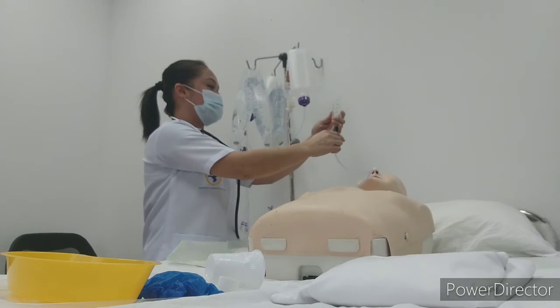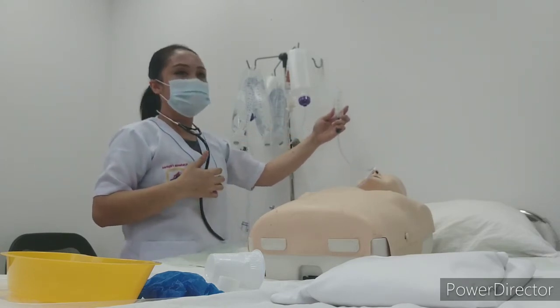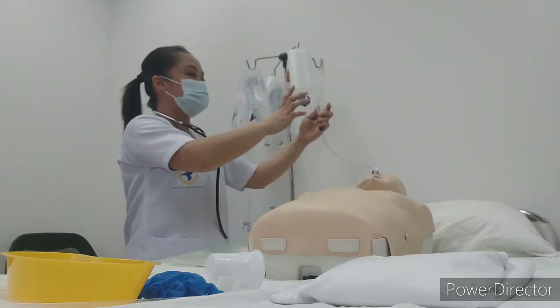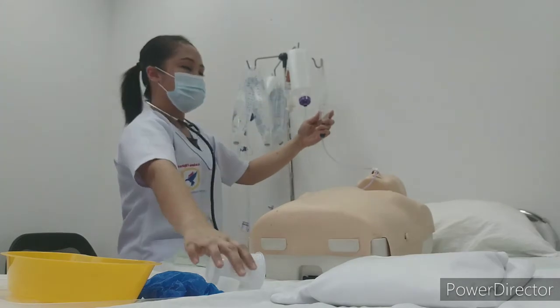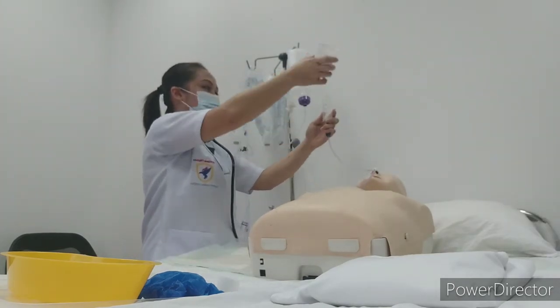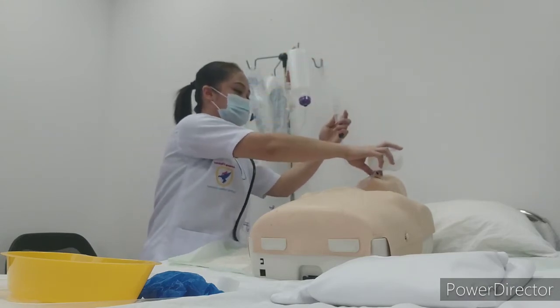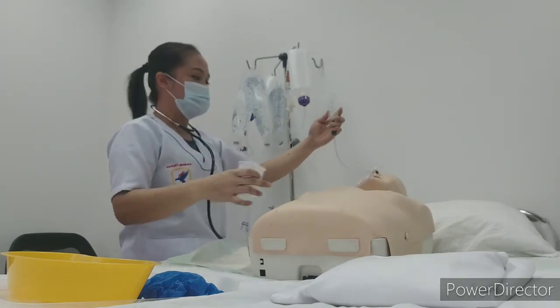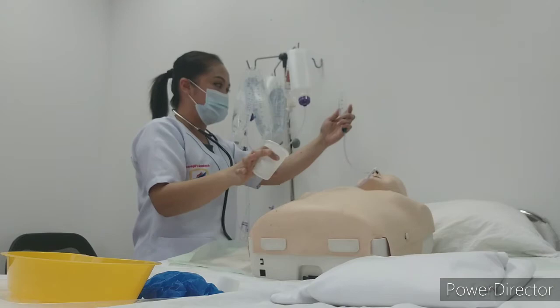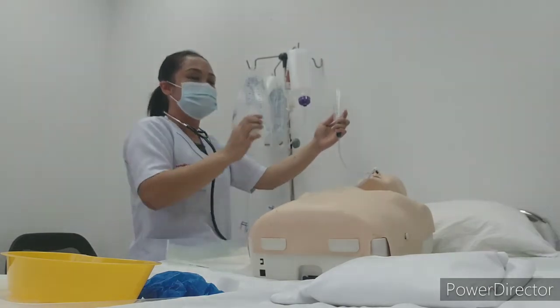So if the doctor's instruction is to order 200 ml, and this is only 50 ml, we will divide it by 4. So 4 times we will feed the patient. 1, 2, 3, 4. So 200 ml of feeding. So after the feeding, when it finished, it's inside already. Again, water flushing. Before and after feeding, we will do water flushing.